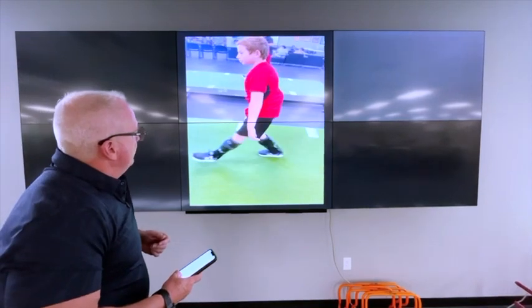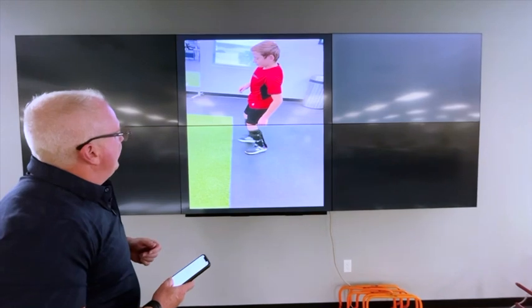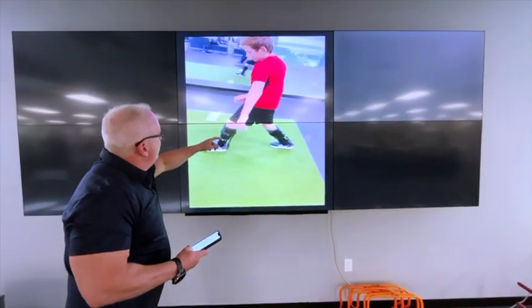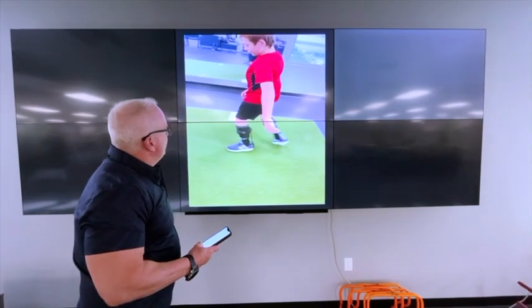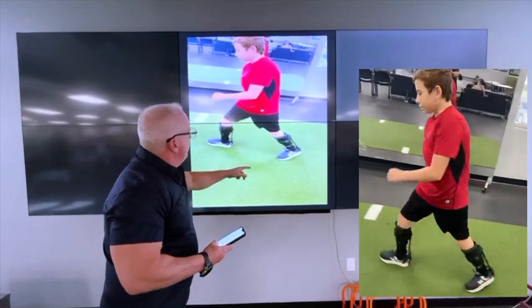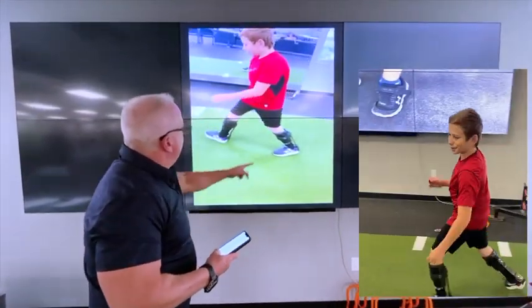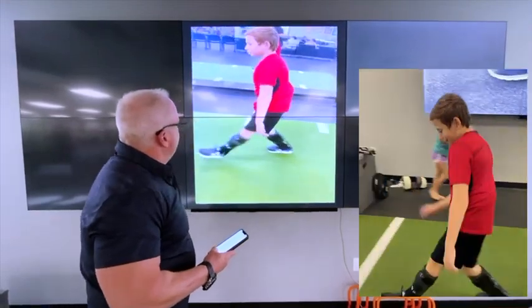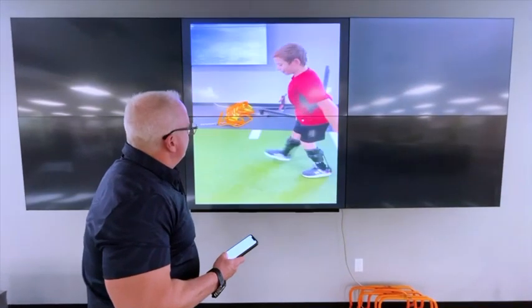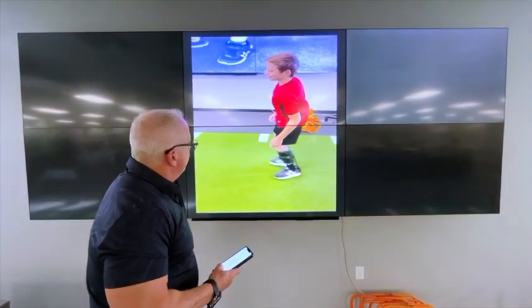And if we take a look now at what's happening, he's not only able to walk much faster, but watch how his knee doesn't go into hyperextension. It goes into stance flexion like we want, and it stays in stance flexion. And what's happening is because of the way that the strut is loading up, it helps propel him through. Not only does he take a much longer stride as he's walking, but he's able to stay in that stance flexion, and that knee doesn't go into extension.